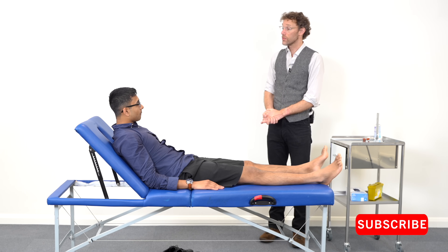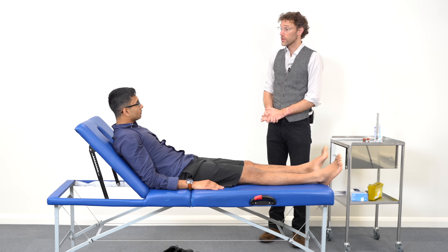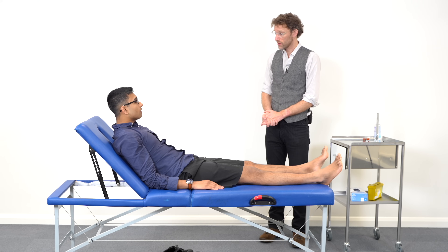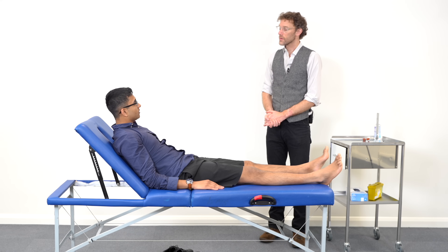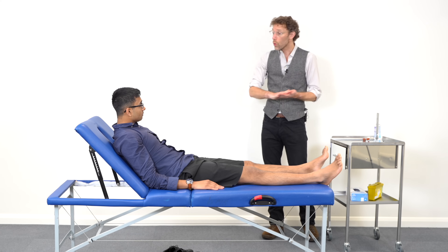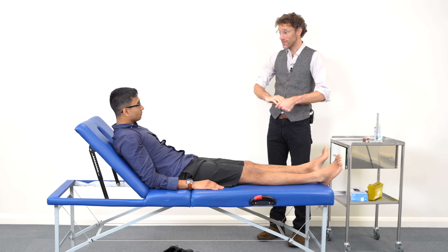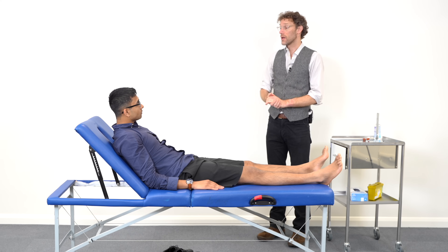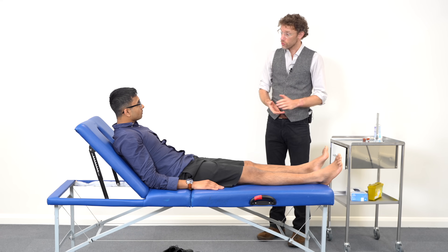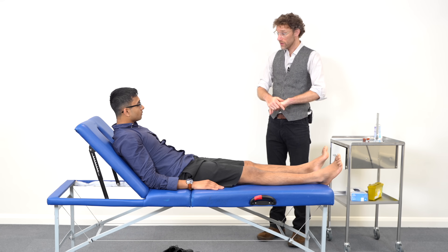Hello, my name is Dr. Gill. I've been asked to do a diabetic foot assessment on yourself. Before we go any further, could you please confirm your name and date of birth? Atavis Alvi, 4th of January, 2000. So in terms of doing this examination, it's going to involve you walking up and down so we can have a look at your gait. I'm going to be pressing around your feet, and also applying a monofilament and a tuning fork to your feet to make sure that you have good sensation. Are you happy to proceed with this? Yep.